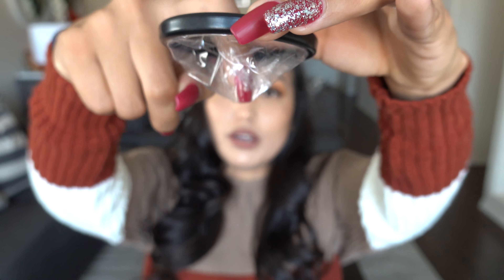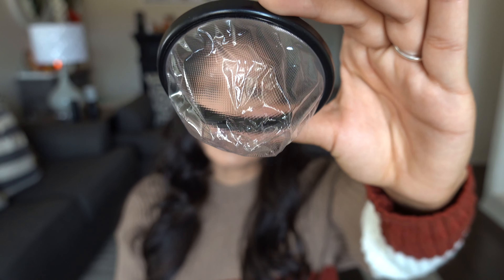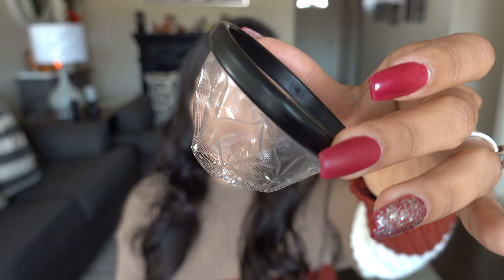This right here is the correct way, and if I push it the opposite direction, this is actually the wrong way. You want to have it oriented correctly because I was a little confused when I first used it. They also recommend that you keep the little bag so that when you are done and switching to a new disc, you can stick your used one back in the bag to dispose of it.